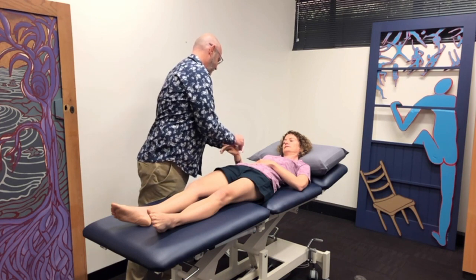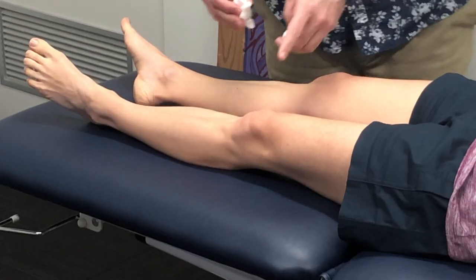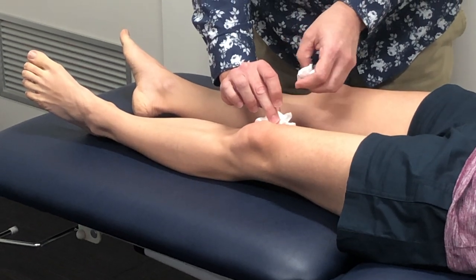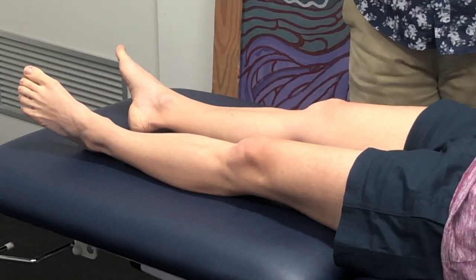Yeah, I can feel that. And what do you feel there? Just cold. Not uncomfortable or painful. So just on this knee, what are you feeling there? Just cold. Similar to my hand, same — not painful or uncomfortable. Okay.